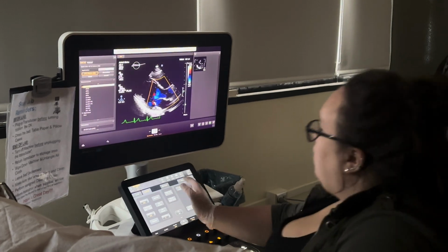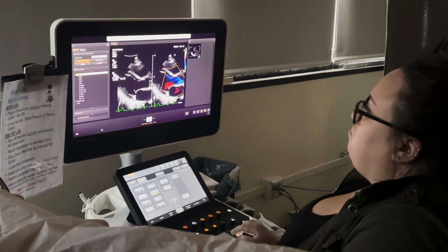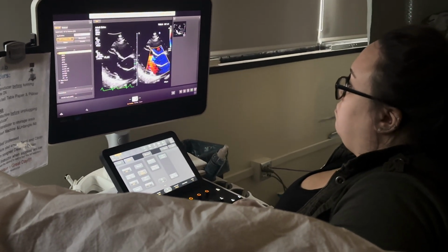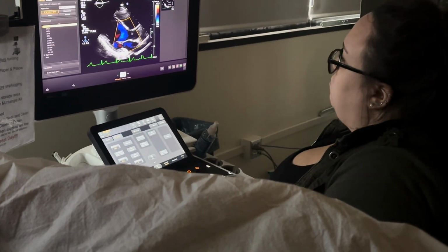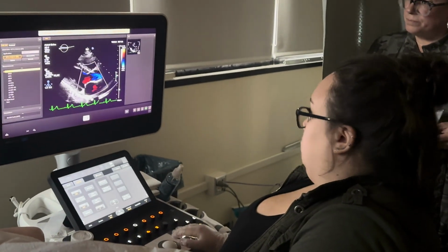Oh, okay. I was taking two different pictures. Do you want that sector that big? It depends though, you need to check. Does your B mode image look like crap when you turn the color on? Then I wouldn't take it. I would take them separate, but per patient, figure it out. Okay, so she's got color on both valves for this one.